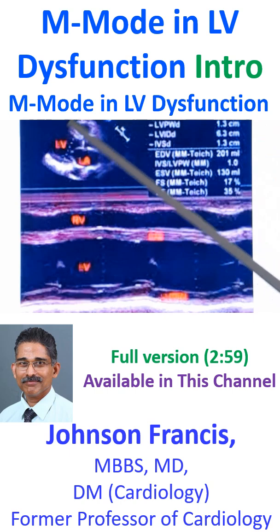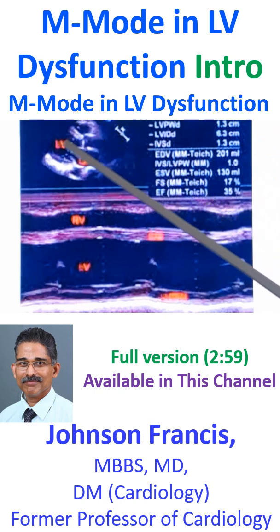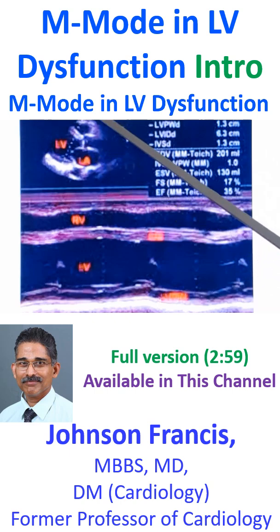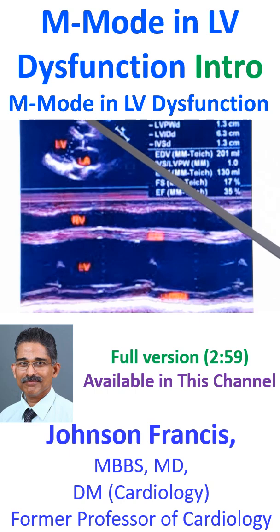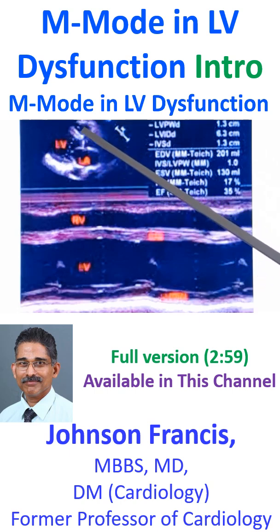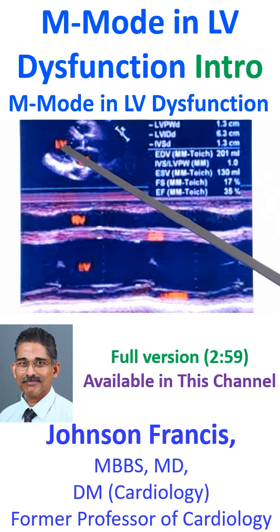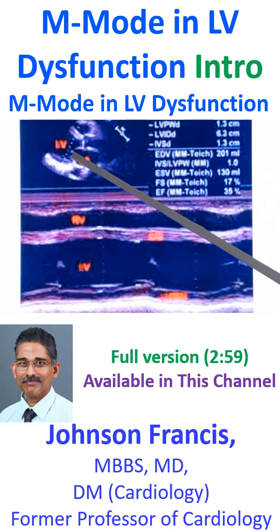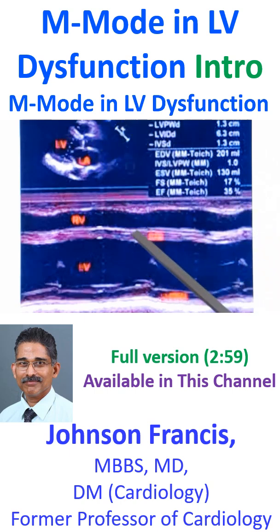In the inset you can see the two-dimensional image location of the transducer here in the parasternal region. This is the parasternal long axis view, showing the right ventricle outflow tract, left ventricle, left atrium, aorta, aortic valve, and mitral valve. These are the things you are seeing in that inset image.